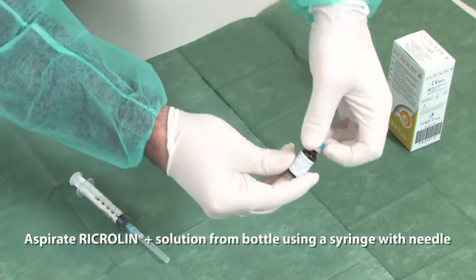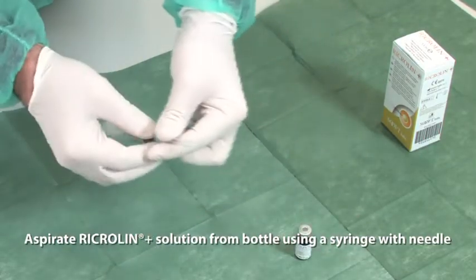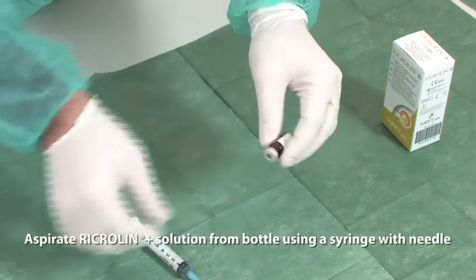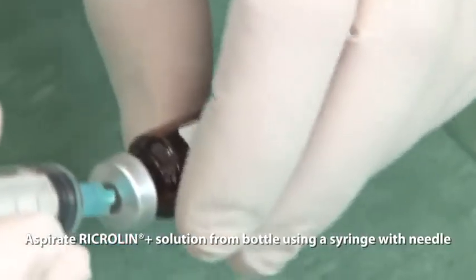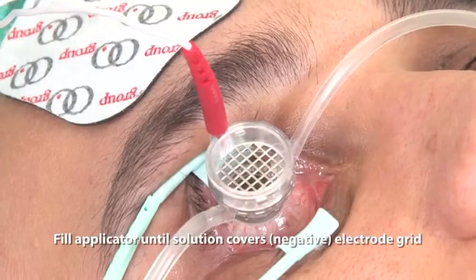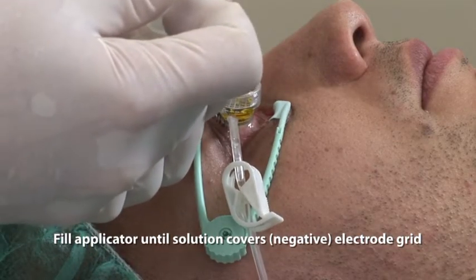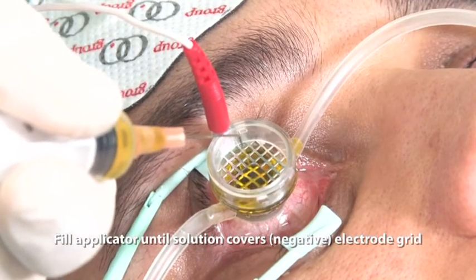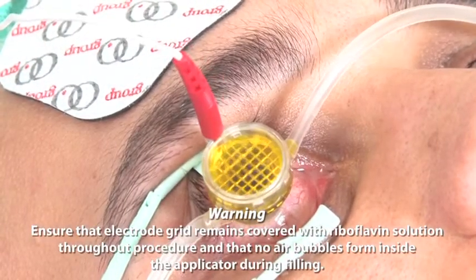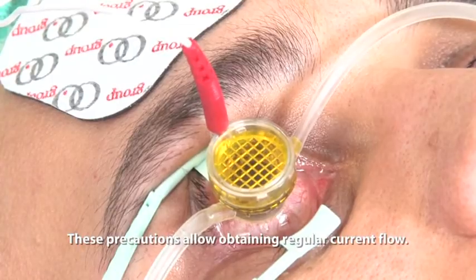Aspirate Ricrollin Plus solution from the bottle using a syringe with needle. Fill the applicator until the solution covers the negative electrode grid. Ensure that the electric grid remains covered with riboflavin solution throughout the procedure and that no air bubbles form inside the applicator during filling. These precautions allow obtaining regular current flow.